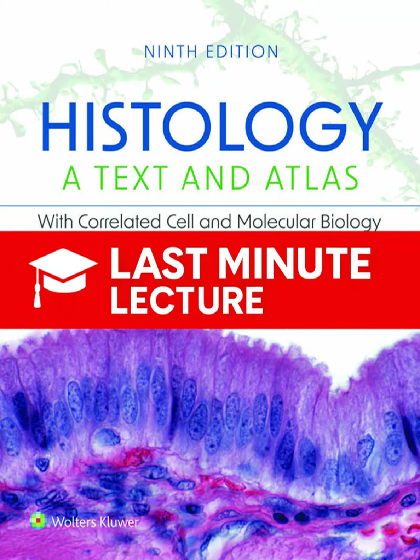Just look at the comparison in Figure 1.10. Panel A is a normal H&E, and B is an immunofluorescent image of mammary gland tissue. Both are at 40x magnification. The nuclei are all crowded together. But then you look at panel C. Panel C is the adjacent section processed with ExM, imaged at the exact same magnification. And the improvement is just dramatic. Structures that were crowded, like the nuclei, are now clearly distinguished. This allows for optical diagnosis at a resolution that you used to need an EM for.